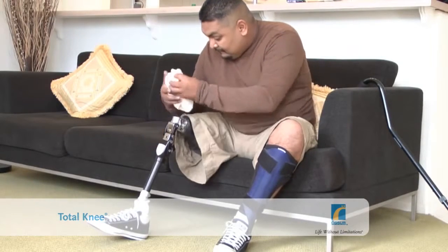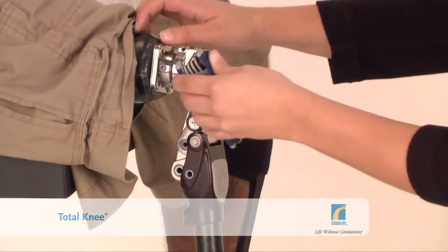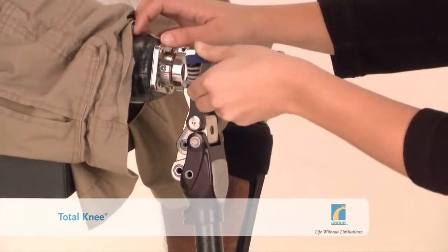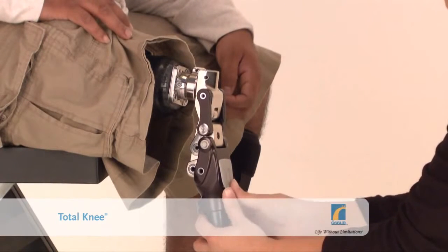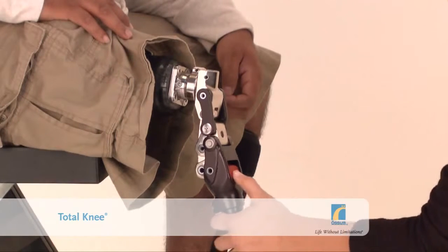Remember, if you have any concerns about the function or condition of your total knee, always talk to your prosthetist. And, as you get used to the knee and become more confident, you may benefit from adjustments that can be made to the swinging motion, the shock absorber, or the locking point of the knee.